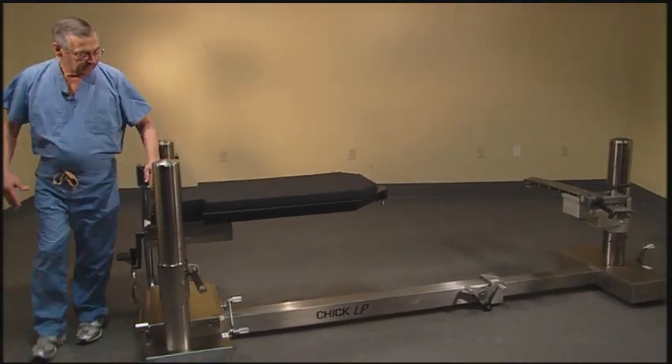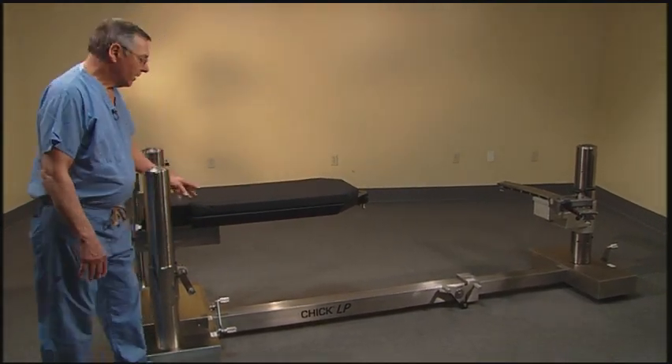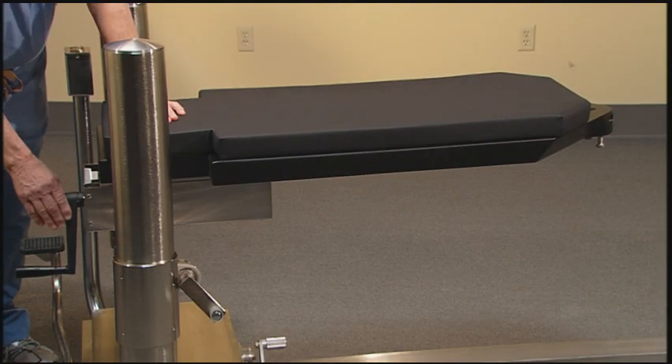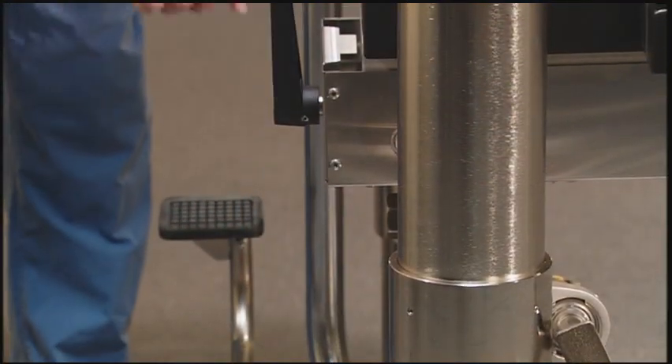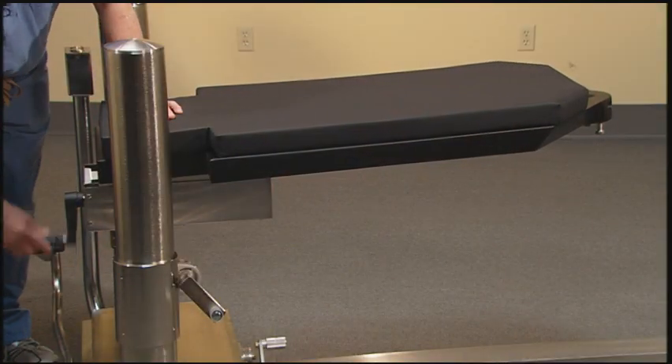For example, the tabletop will now lift and articulate a 500-pound patient. If during the procedure it becomes necessary to activate Trendelenburg, that can be achieved by using the crank at the head end of the table, and we can get 10 degrees of Trendelenburg.